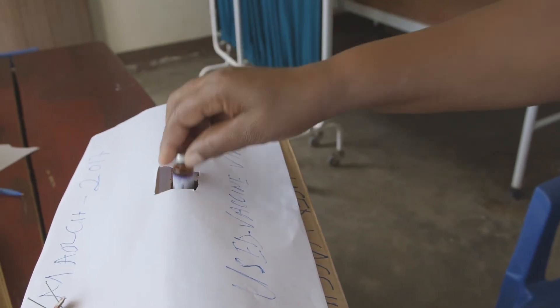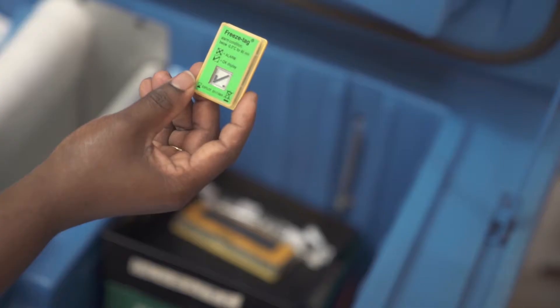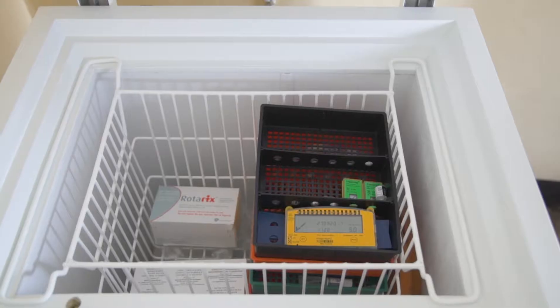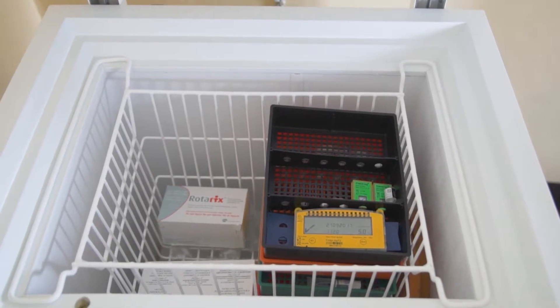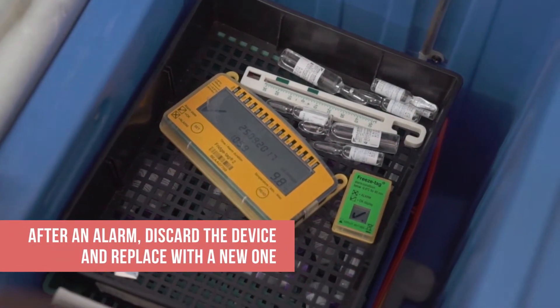This alarm should trigger a shake test to determine if the vaccine has been damaged. If so, the vaccine should be discarded. The device can be used until the built-in battery expires. However, the alarm on these devices is irreversible, so once an alarm is triggered, the device cannot be used again.